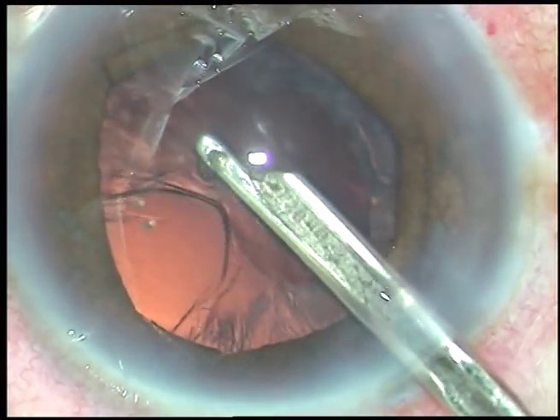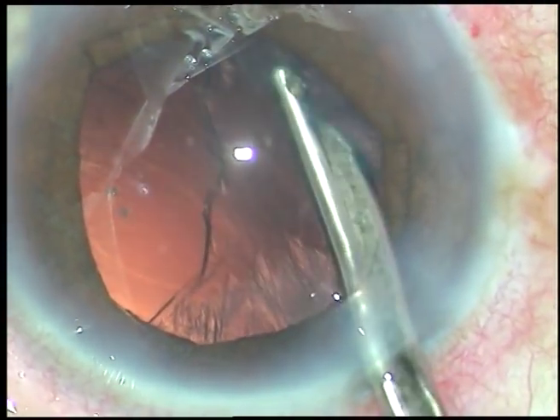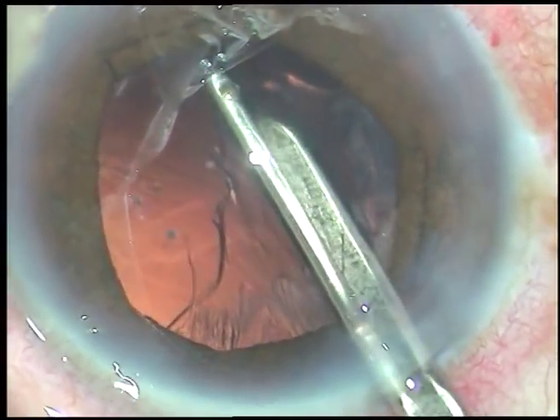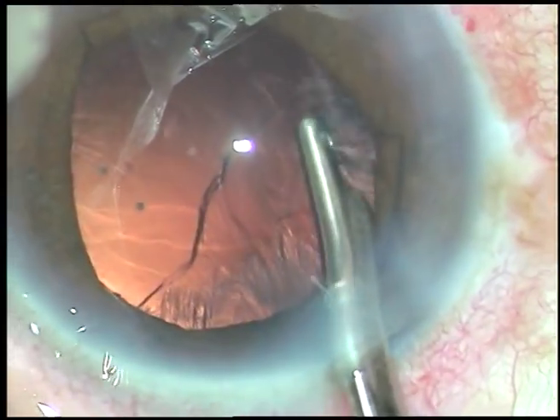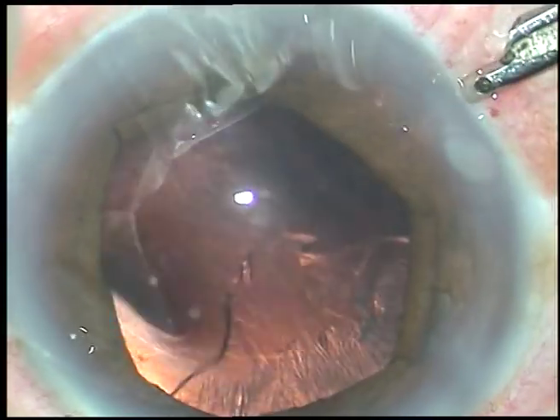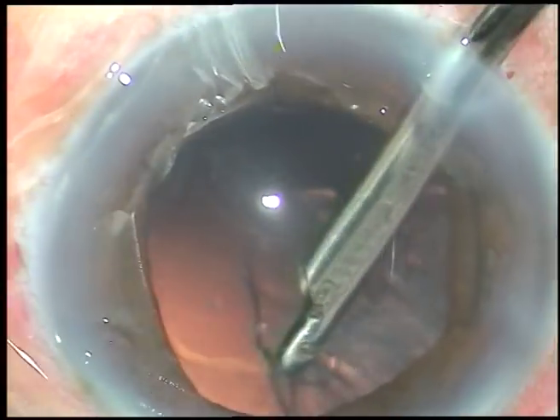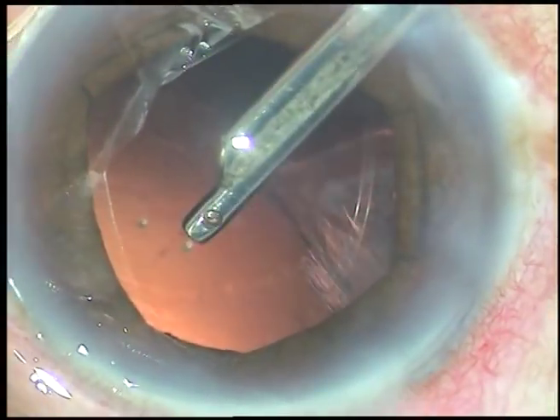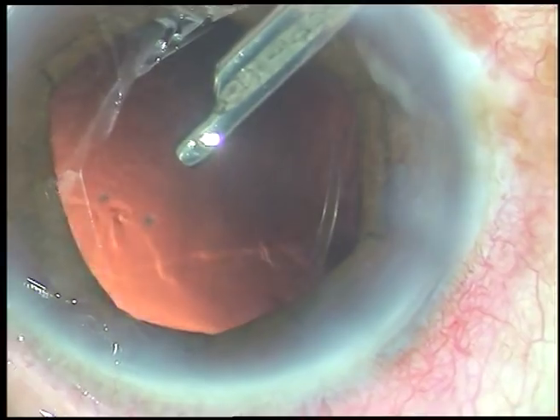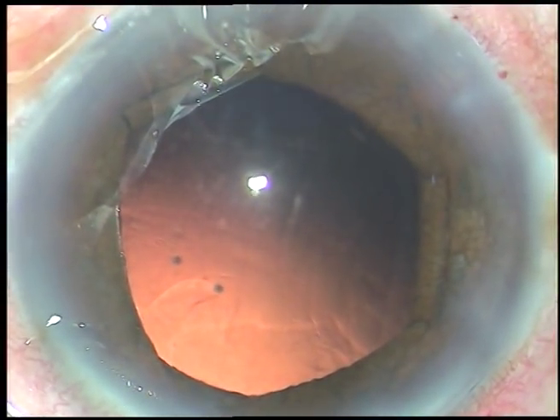Cortex is being cleaned at this moment with a 23G Simcoe. Cortex is removed.